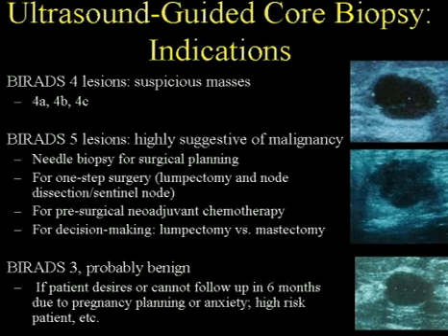And to briefly go into why we do a biopsy, the different indications, and this is true for ultrasound-guided core biopsy, but really for all breast lesions. The majority of the lesions that we will biopsy are BI-RADS 4 lesions, which Dr. Frenna discussed for ultrasound, for A, B, and C. And usually with ultrasound, these are masses, such as these illustrated here.